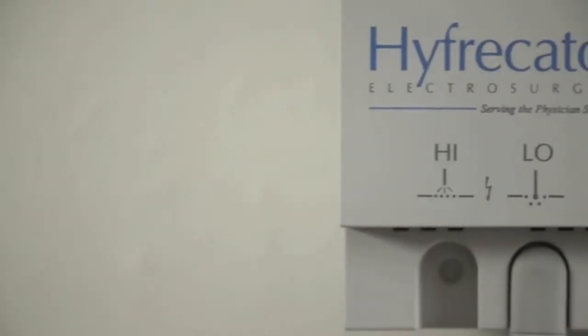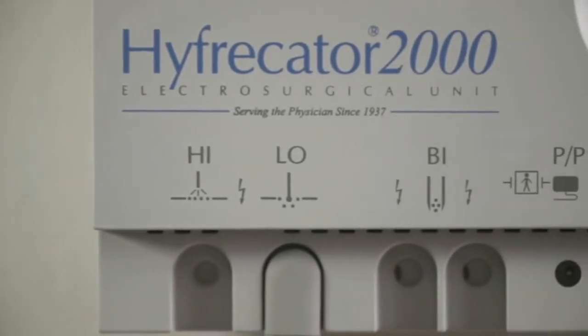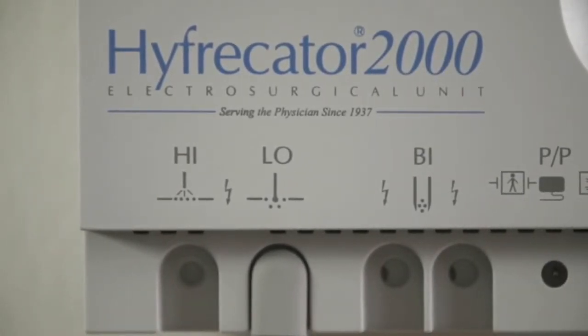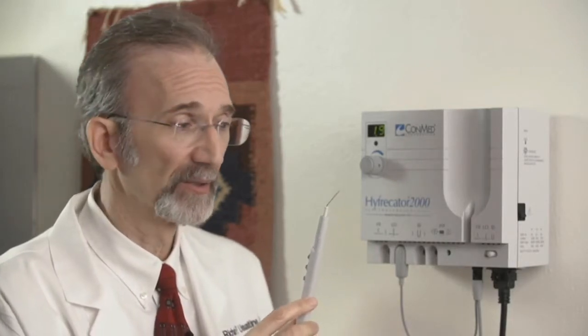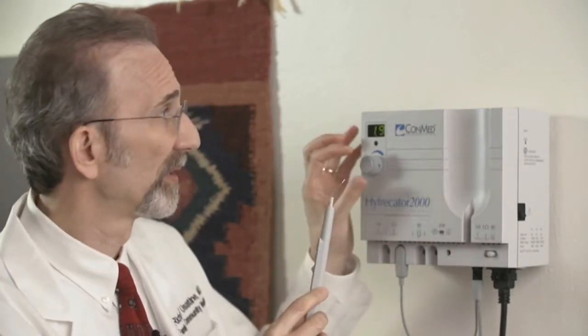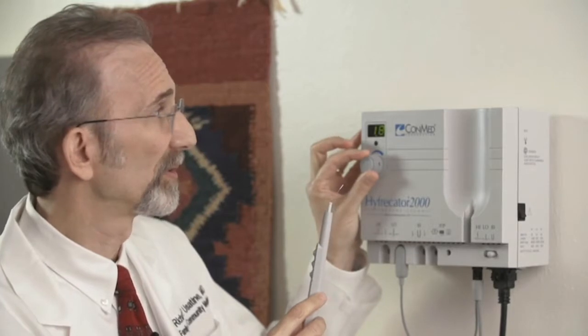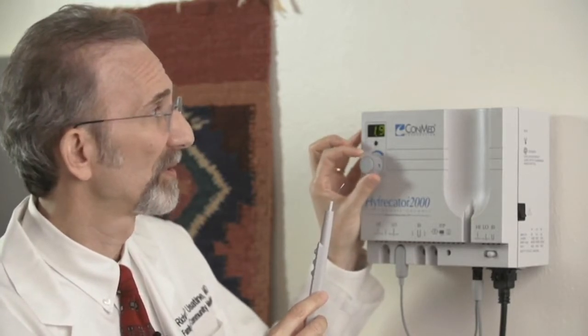The hyfracator 2000 has two main settings, the low and the high, and also there's a bipolar setting. I mostly use the low setting, and the low setting has the ability to start with small numbers, even with decimal points.